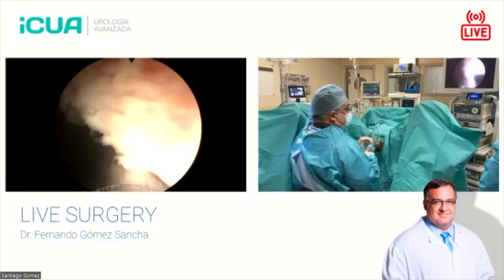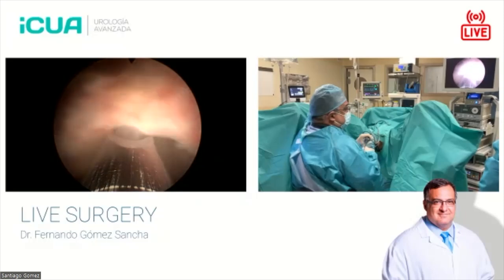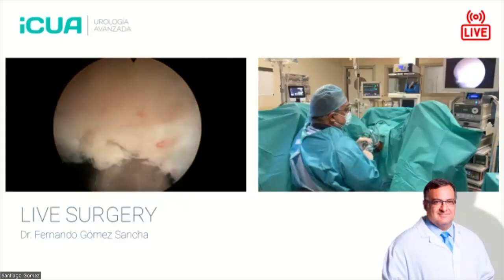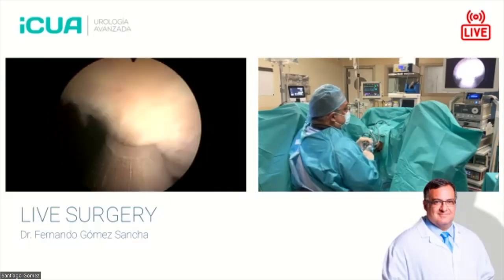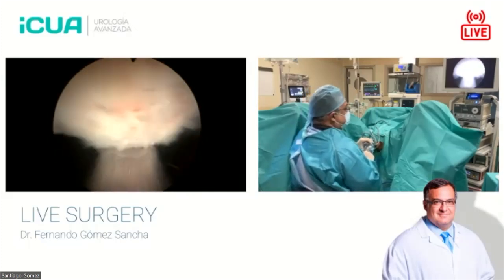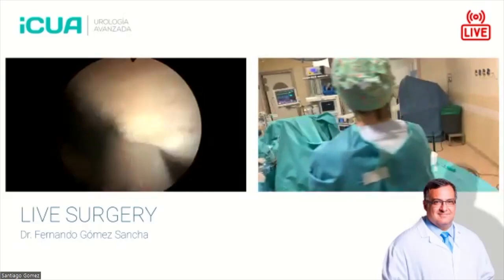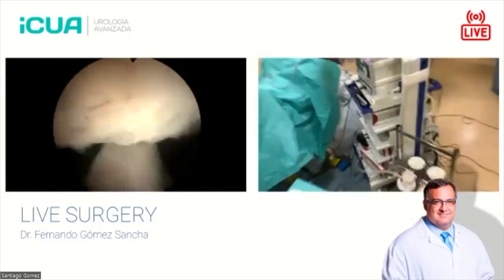Regarding bladder neck, I don't know how to prevent it. I don't know if it is a matter of perforation. But I see horrible perforations which do not... not horrible. What I'm saying is sometimes you go very deep, you fear that there will be a stricture and then there's no stricture. And sometimes you get a stricture in someone you wouldn't expect. So I don't think we know what is the factor that predisposes for bladder neck strictures.